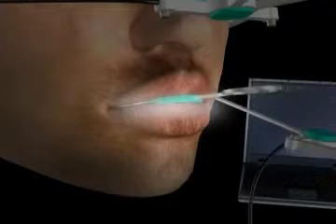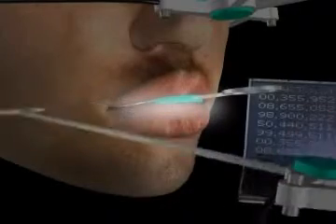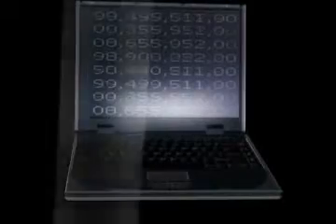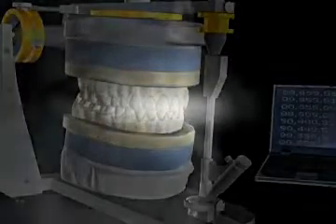To obtain individualized patient values, one would have to analyze the patient's masticator organs through axiography. In this process, a computer records the various parameters of lower jaw movements. This data can then be used to program the articulator. Unfortunately, the axiography does not always generate values that can be reproduced. Multiple axiographies frequently lead to different values for the same patient.